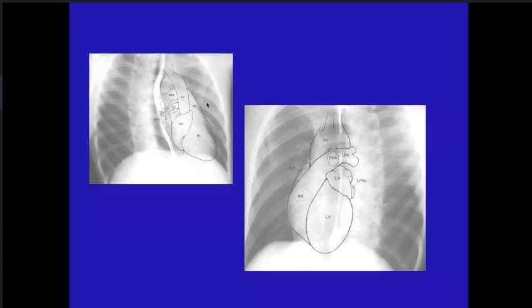Now, when you come to the cardiac anatomy, when you rotate the heart in RAO view, the right atrium still forms the right border, but now it is the posterior border. No longer the right border, because in RAO view this becomes the posterior border. Now, because you have rotated the heart, the SVC doesn't form the cardiac border. Now the left atrium comes and forms the posterior cardiac border here. Left atrium and pulmonary veins form the border.